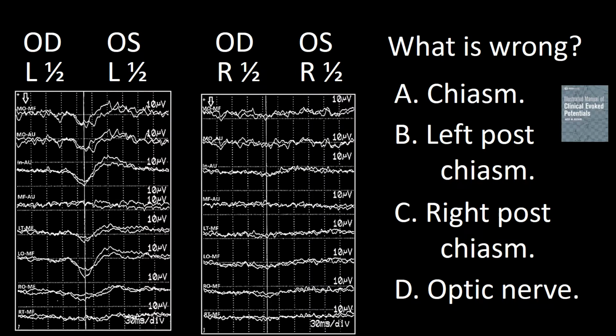Next question. Please take a few seconds to look at this frame and choose the correct answer. A. Chiasm. B. Left postchiasm. C. Right postchiasm. D. Optic nerve.